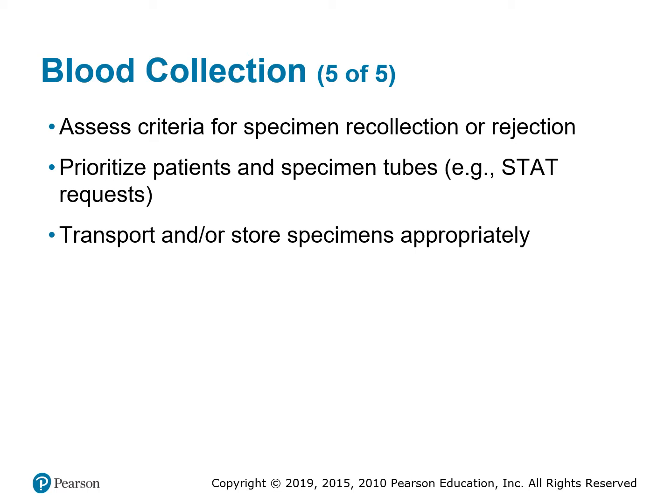That's a gimme. And basically a biohazard bag is to keep contamination from transferring from patient to patient, all over the hospital. Because we do go into precautionary patient rooms where they have an infection that is contagious. So we have to take proper protocol and bag it up in a biohazard bag. Sometimes we call it double bagging, where we put the tubes in one bag and then we put it in another bio bag.